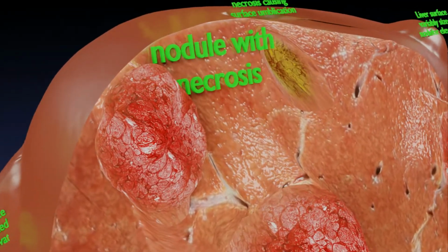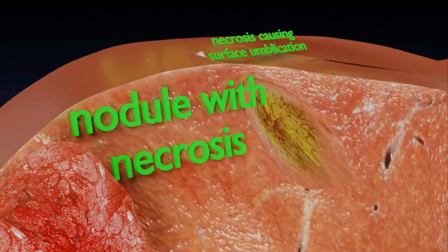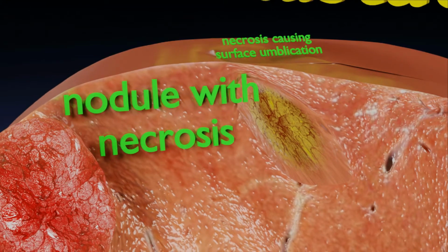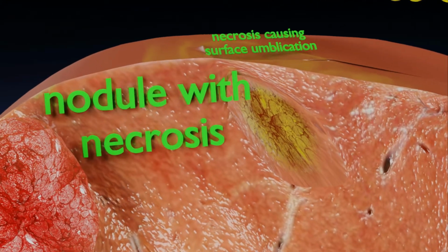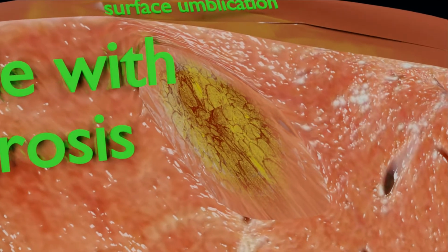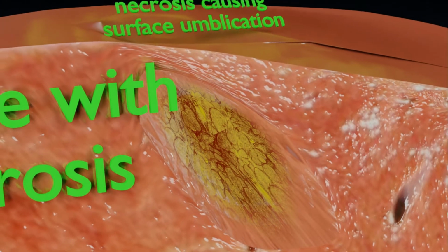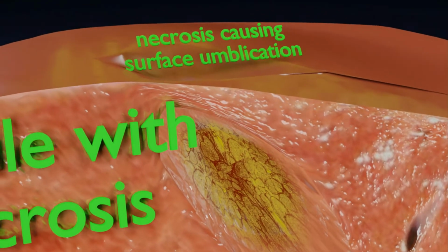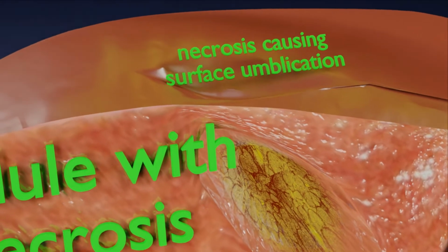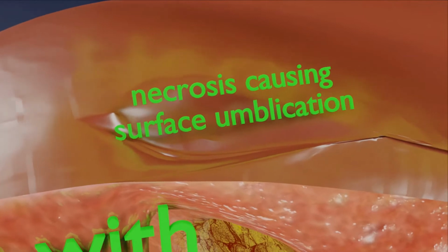In this view, you can see central necrosis of one of the nodular masses, which causes characteristic umbilication of the liver surface. The reason for this umbilication is that there is a tendency of metastatic nodules to outgrow their blood supply, producing central necrosis. Here you can see the characteristic umbilication.